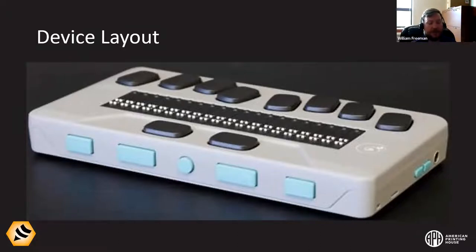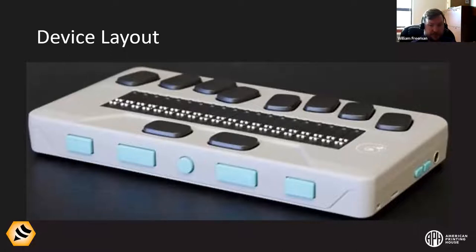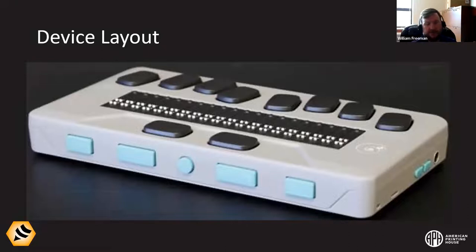Below the USB-C port is the power button. You can tap it once to put the device to sleep, or press and hold it to power off the device. Below that is the USB-A port, which is for thumb drives. If you have a thumb drive and want to transfer something to or from the device, that's where you plug it in. The device has 16 gigs of onboard storage, and you can use a thumb drive up to 64 gigs.